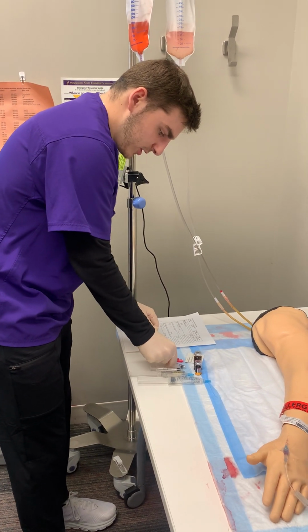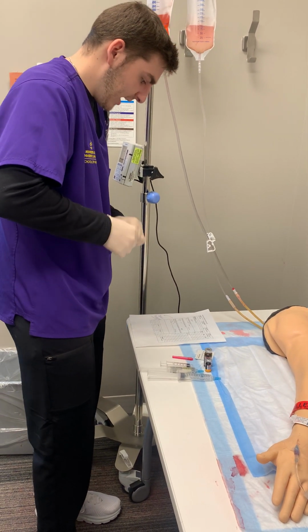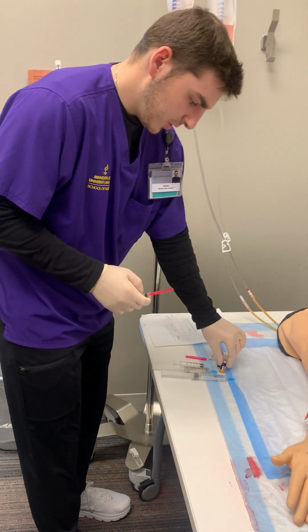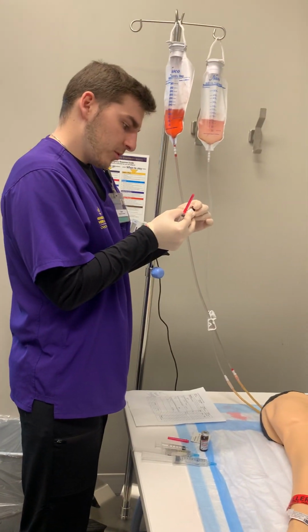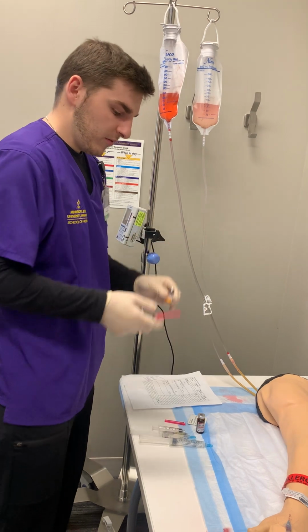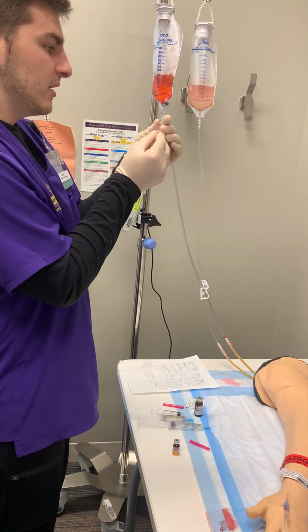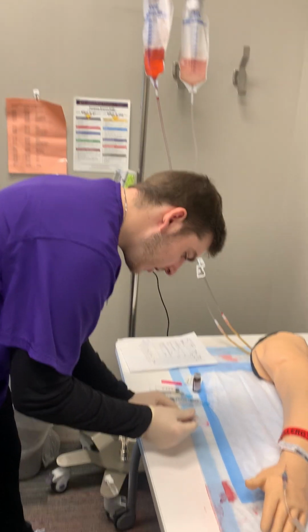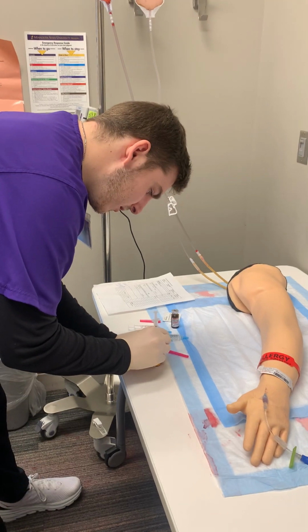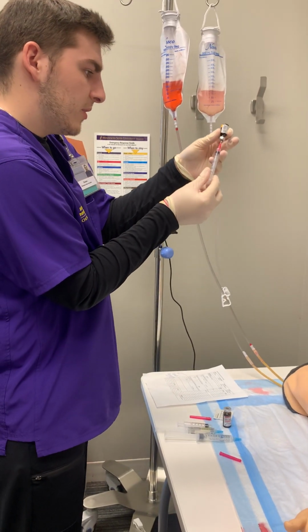So first I'm going to draw up ketorolac, and we're looking for 15 milligrams, and on here it's 30 milligrams per milliliter, so we're going to draw up a half of a milliliter. So I'm first going to inject half a milliliter of air into my vial. Then I'm going to draw up a half mil.